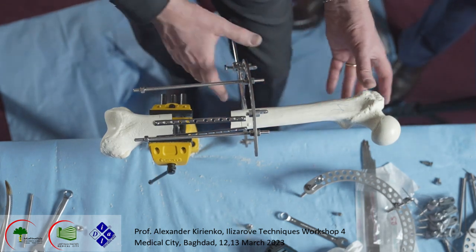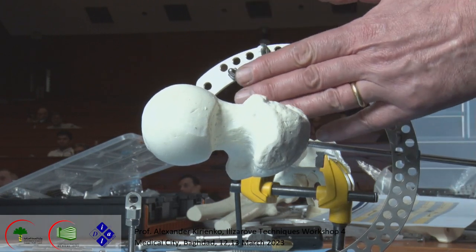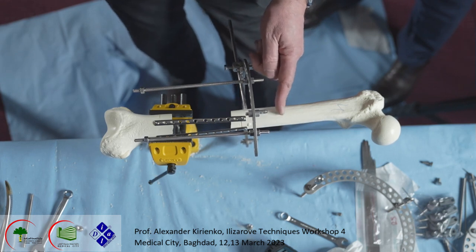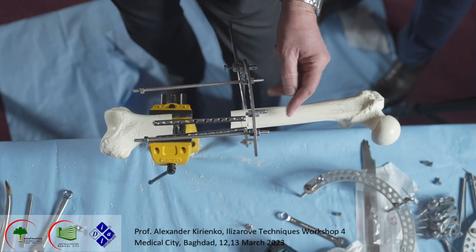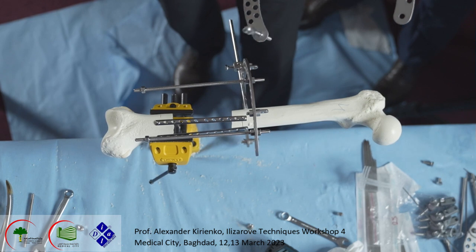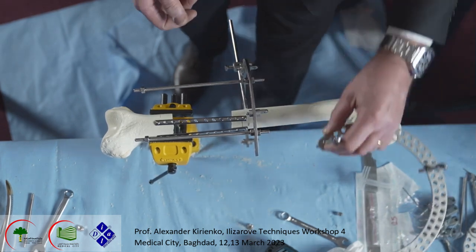Now we want to build this proximal system, because after that we should do an osteotomy of the femur, at the mid shaft of the diaphysis, for doing transport, for lengthening of the femur. And I am always thinking about the probable deviation that may occur during lengthening.